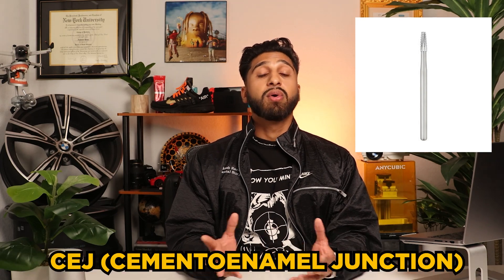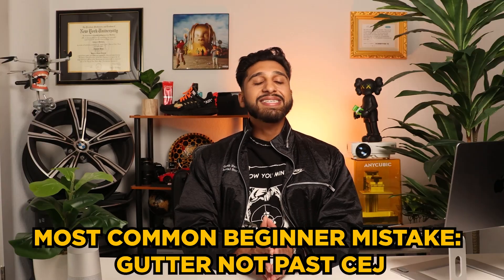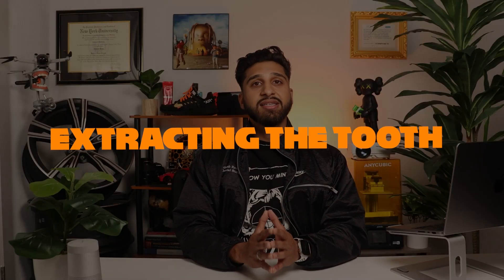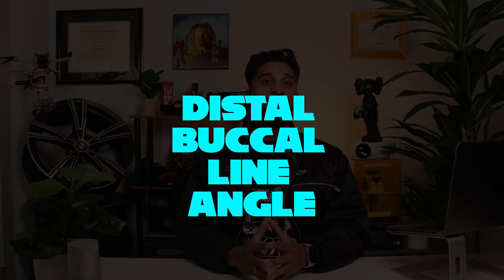Using a 702 burr, we go to the depth of the CEJ — the cemento-enamel junction — and go under it to gain the leverage needed for tooth extraction. In the past, I made the mistake of not going deep enough during this part, and it made extracting the tooth a real challenge. Typically I create the buccal gutter from the mesiobuccal line angle to the distobuccal line angle, and I sometimes extend it to the midline of the tooth. However, if it's not necessary, I try to avoid the distal aspect of the tooth.